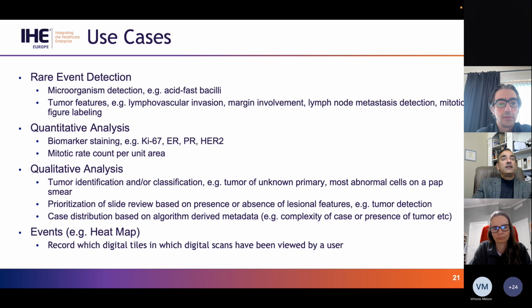And these are things that the machine, through machine learning or image analytics, might be able to assist the human on, or provide a screening function for, or provide a QC check for, to make sure that patient care isn't compromised.